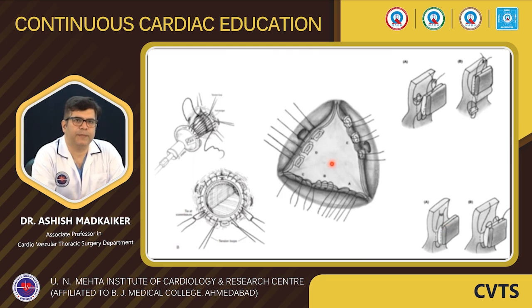This illustration explains different types of stitches which we can take to seat the valve. As we already have seen, we can take pledgeted stitches with pledgets towards LV, which are the non-everting stitches, and towards the aorta, which are the everting stitches. The same stitches can be taken without pledget also, but we should be sure that our annulus is good. The other type of stitch which I would like to mention is the simple single stitch. So one stitch from the annulus, one stitch from the valve, and then tie it. The problem with this is it can sometimes become very messy with a lot of stitches coming along the annulus and too many stitches to tie.